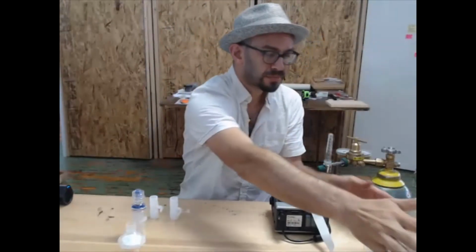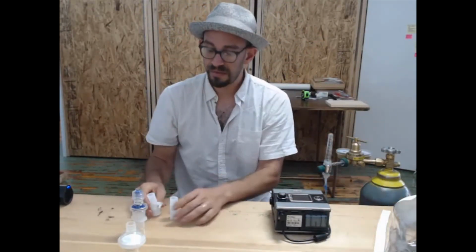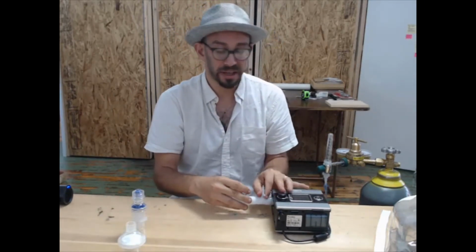Now, let's go ahead and assemble the patient circuit. So the first thing we're going to do is we take these oxygen enrichment adapters, connect them, plug them directly into the outlet on the back of the CPAP.